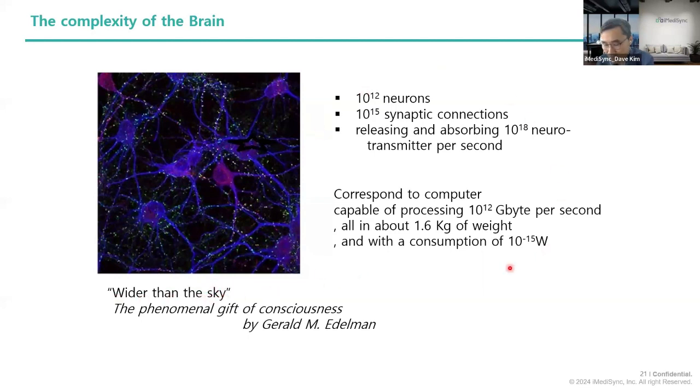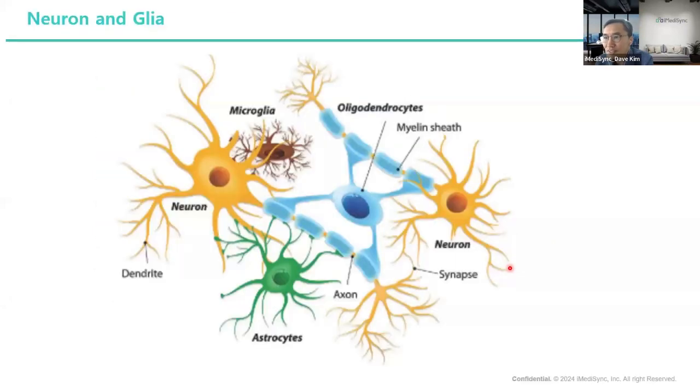It is a very complex system, but actually the brain rhythm generated from that complex system is very simple. The EEG rhythm itself is a simple pattern. That's the beauty of the EEG rhythm, I think.